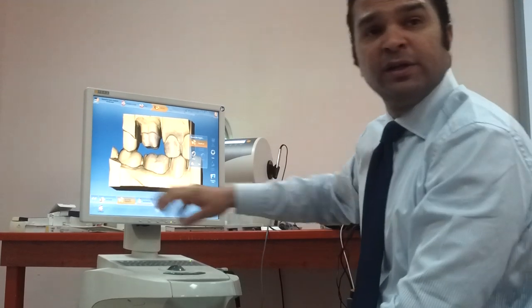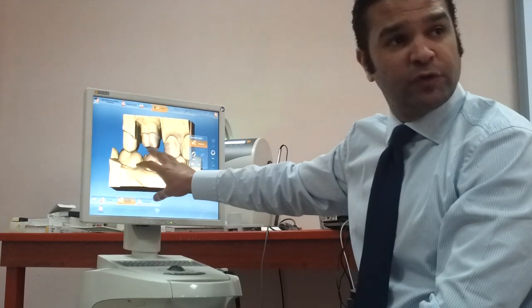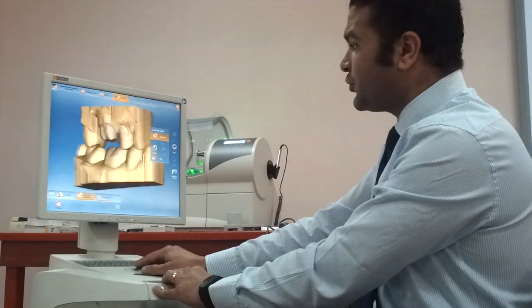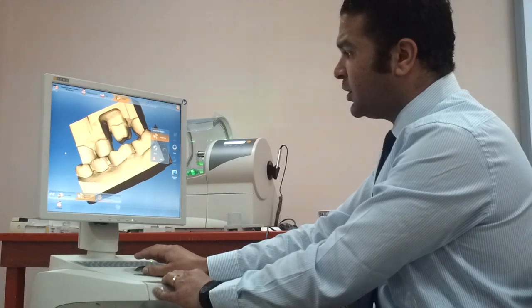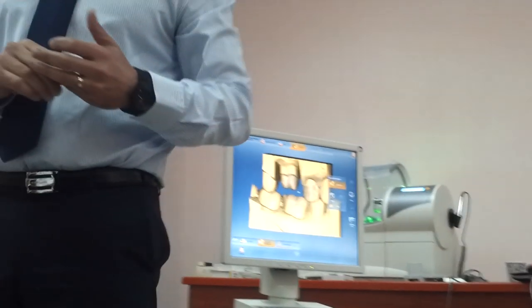I've successfully transferred the patient's bite to the virtual 3D model, where you can rotate the model and check occlusion from the lingual or buccal side. There's also a software from Sirona called Prep Check, mainly made for universities. It's an affordable software where you take an optical impression of your prep — on dummy heads or inside the patient's mouth — and it tells you exactly how accurate your preparation is, including degree of tapering between buccal and lingual walls.